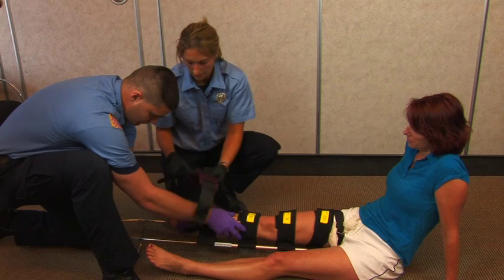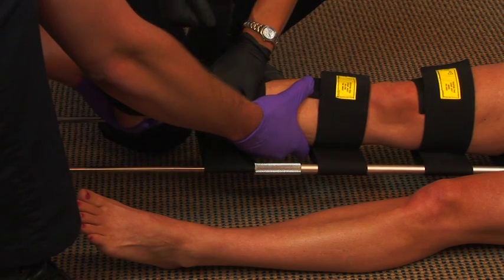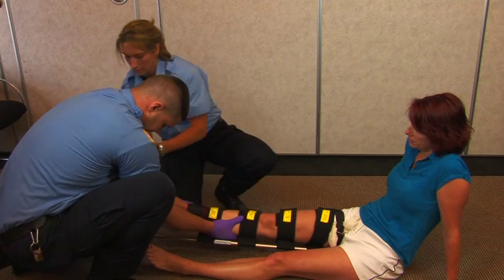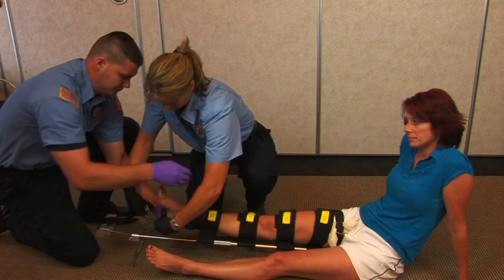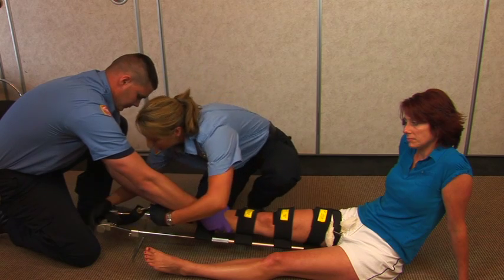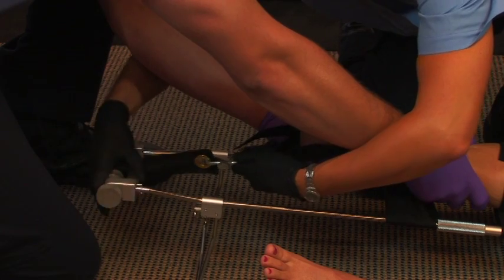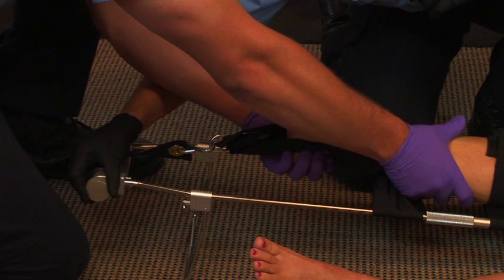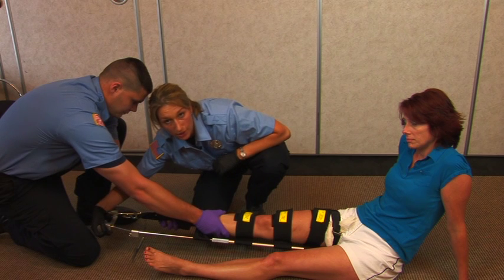The second strap will go above the ankle strap. You're going to apply the hook for the traction and wind. Now you want to wind the traction and have mechanical traction take over where the manual traction leaves off. The patient should feel a reduction in pain.